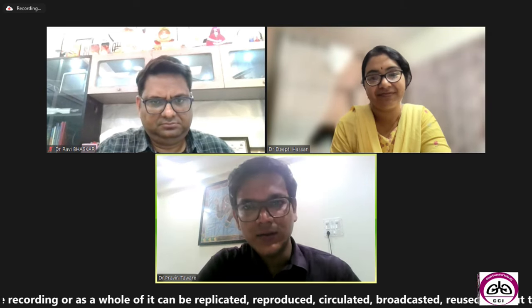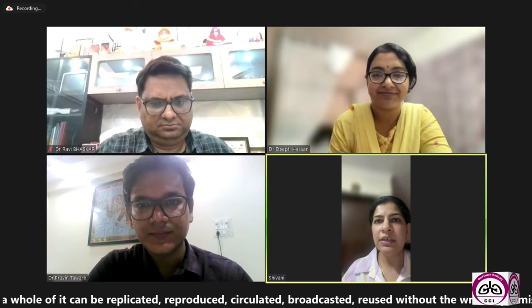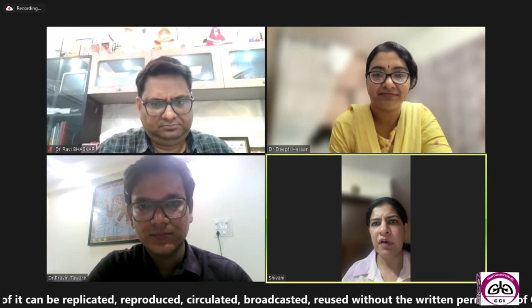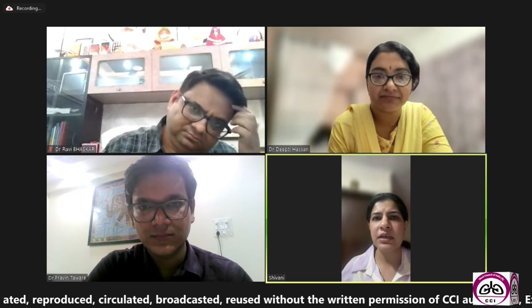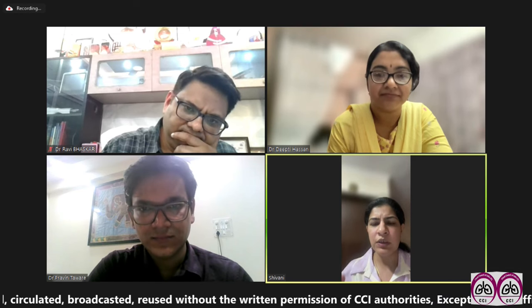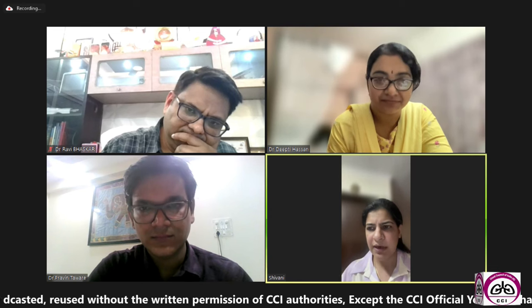Sorry, I think I was on mute. So I think the only thing is that maybe we have one from Zydus, a smart inhaler, in terms of that it actually is connected to cloud and it tells you if the patient has actually taken the dose or missed the dose. So I think we actually have one from Zydus.